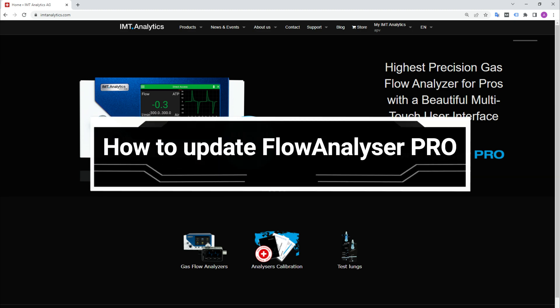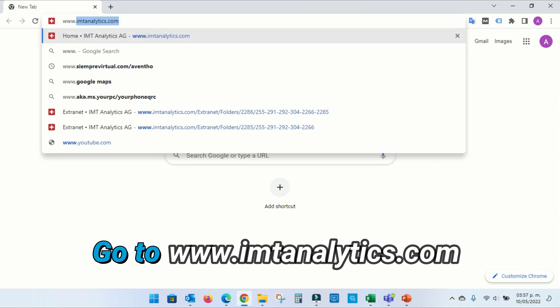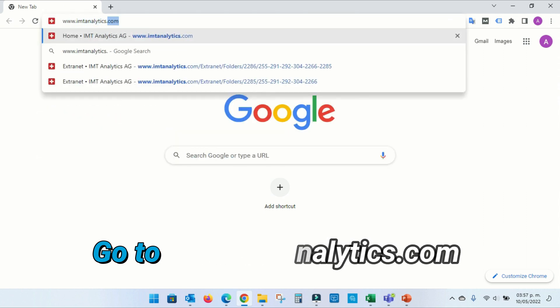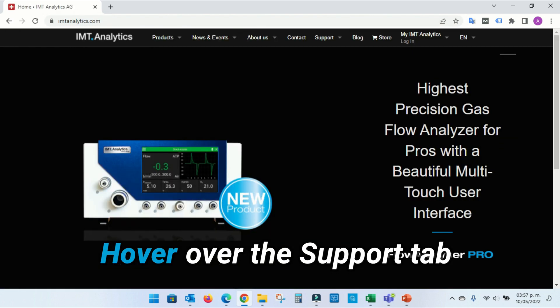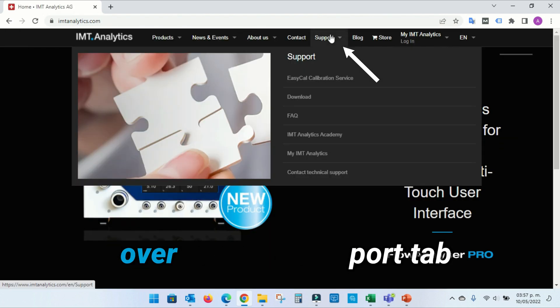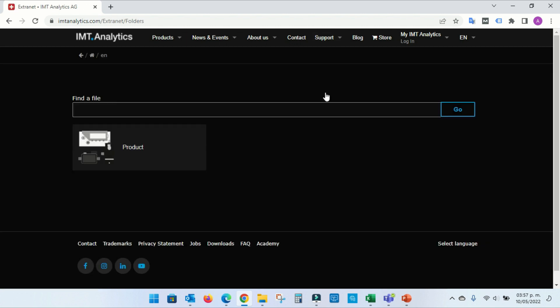How to update Flow Analyzer Pro. Go to imtanalytics.com. Hover over the Support tab and click Download.